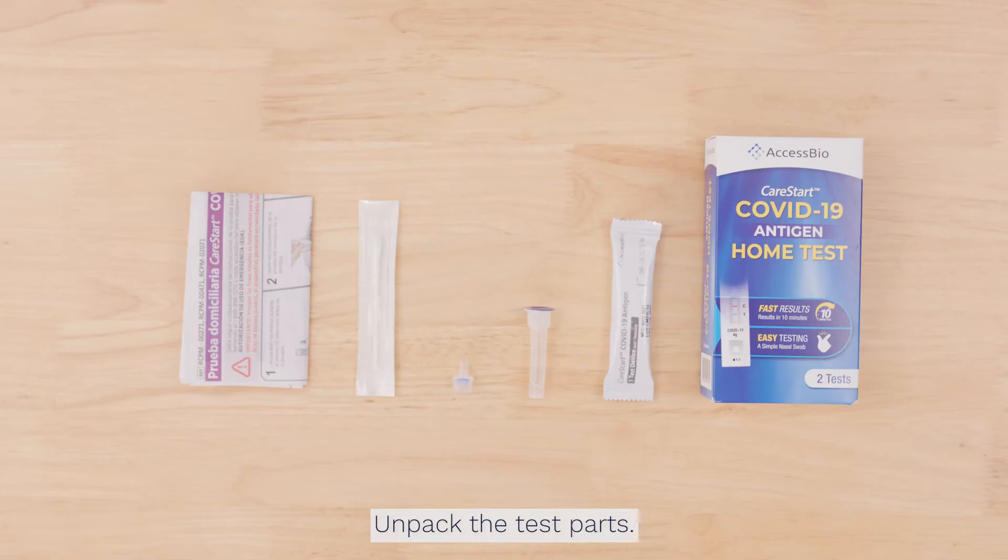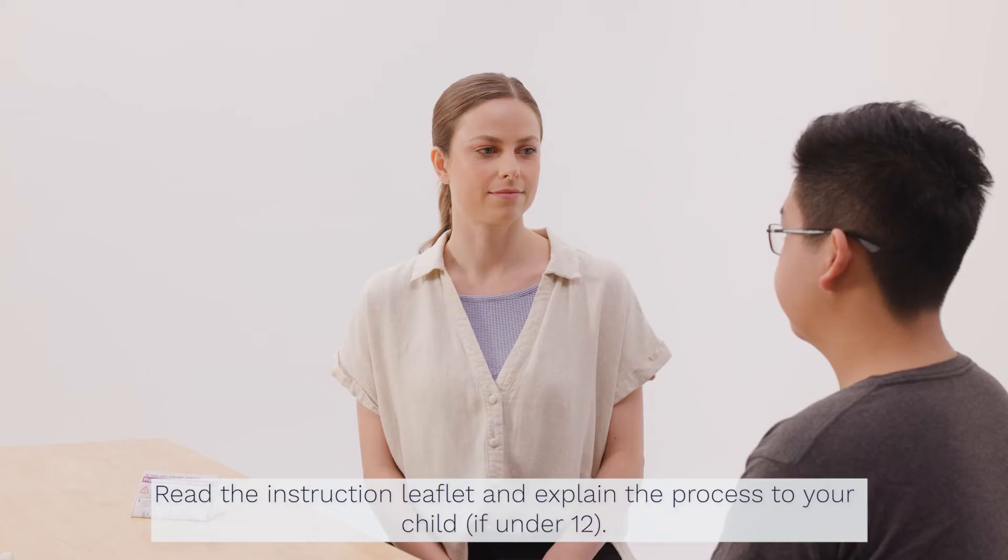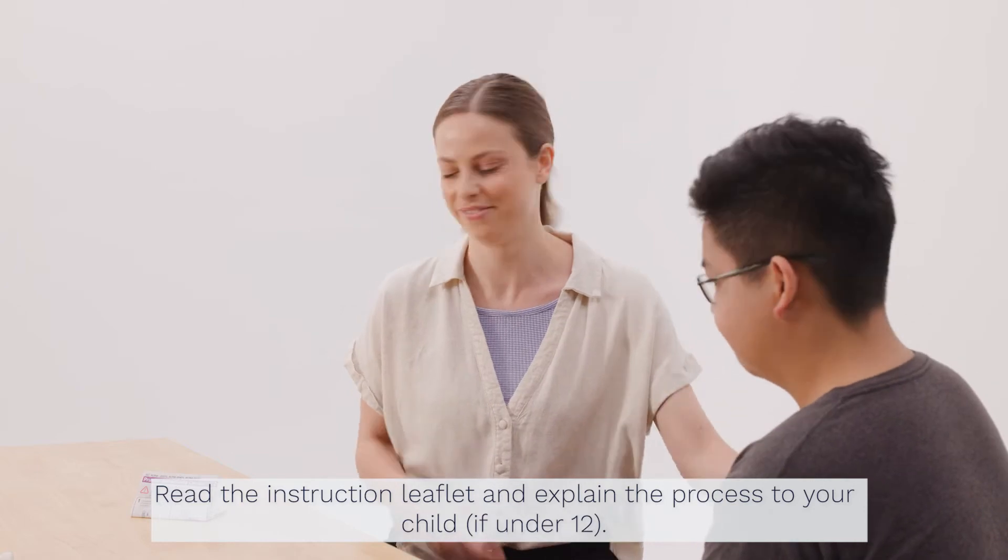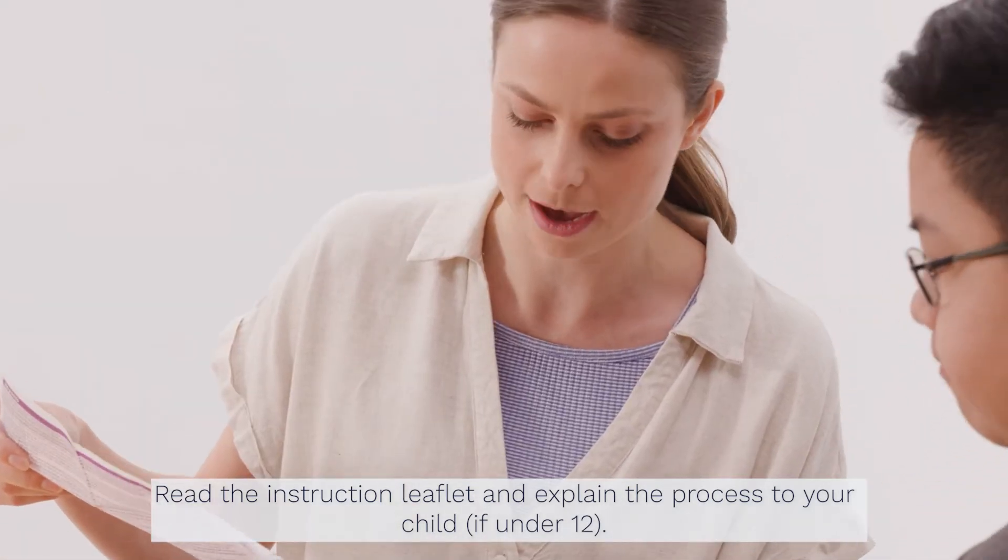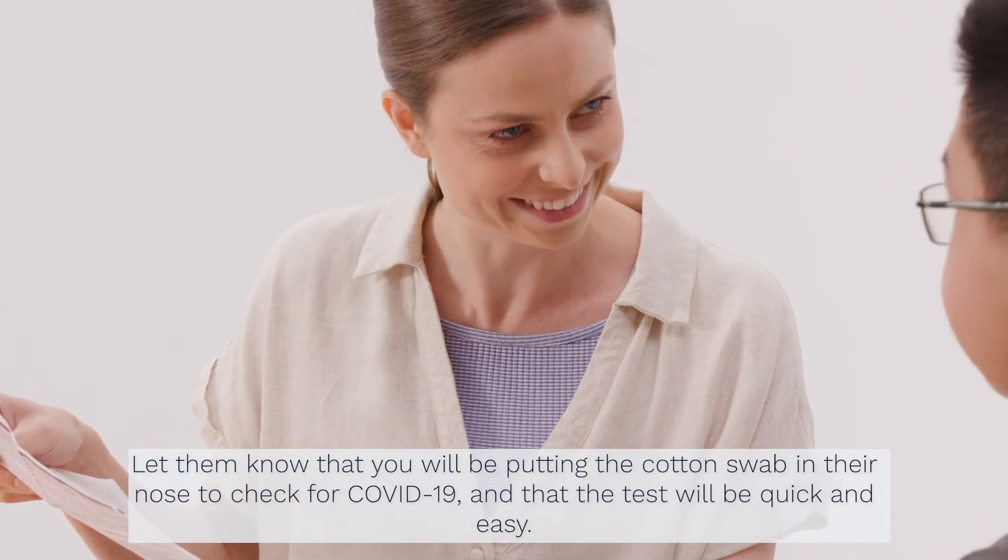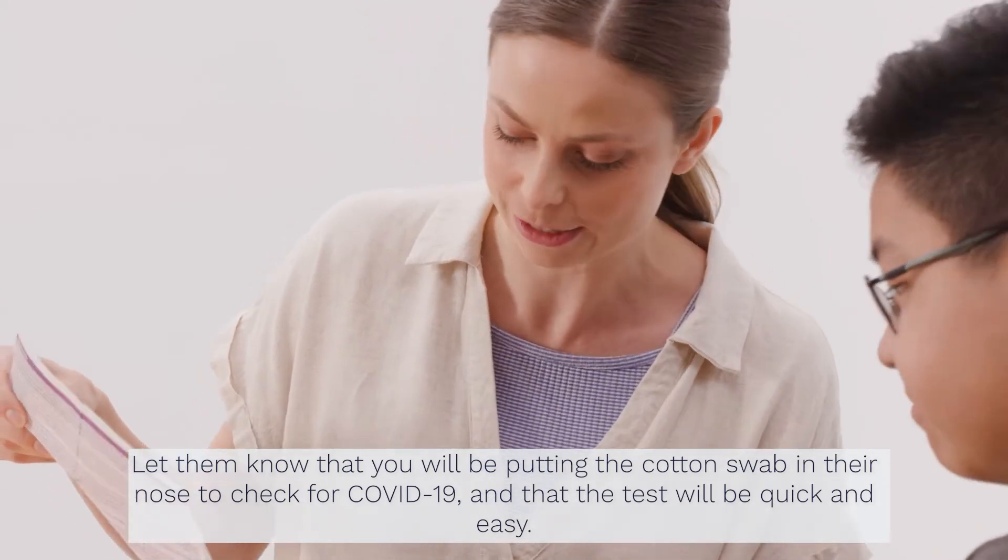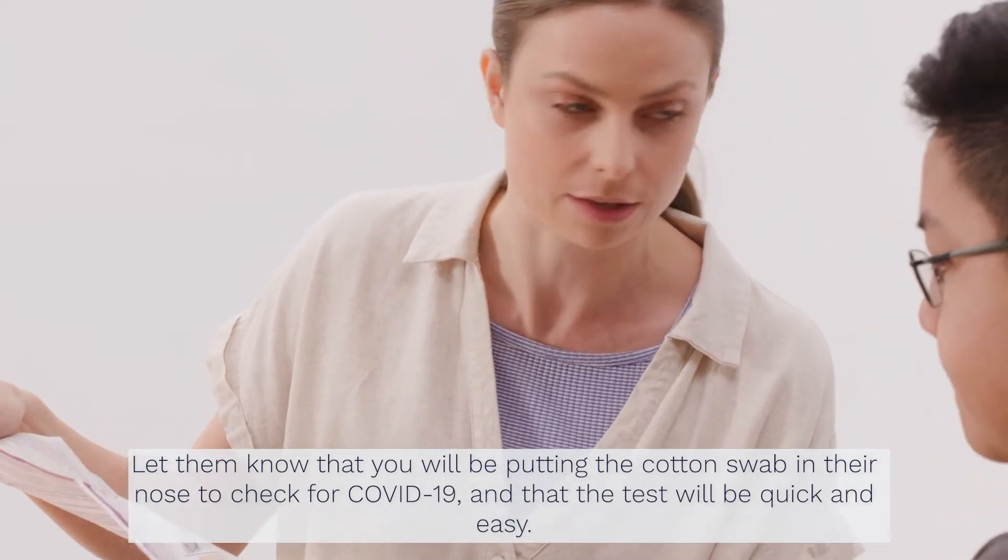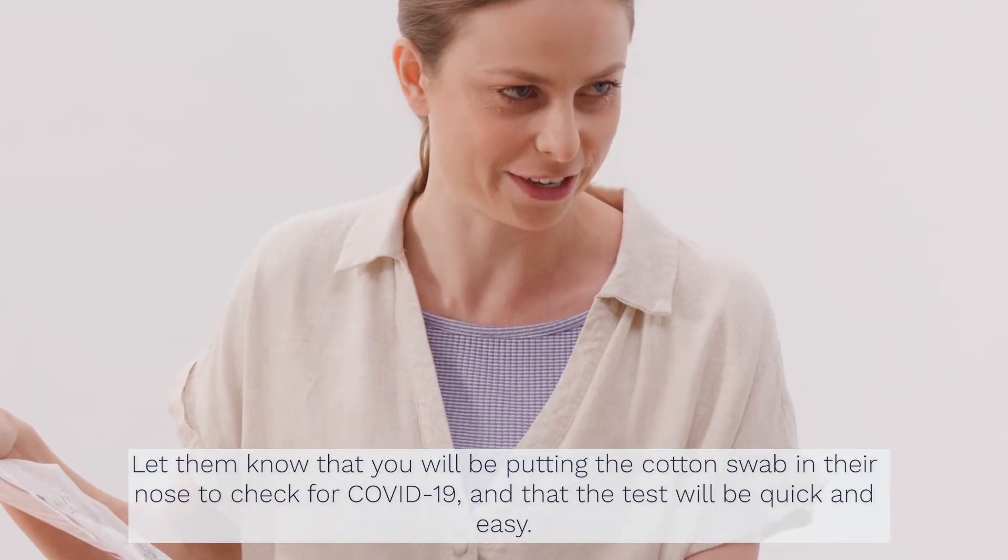Unpack the test parts. Read the instruction leaflet and explain the process to your child if under 12. Let them know that you will be putting the cotton swab in their nose to check for COVID-19, and that the test will be quick and easy.